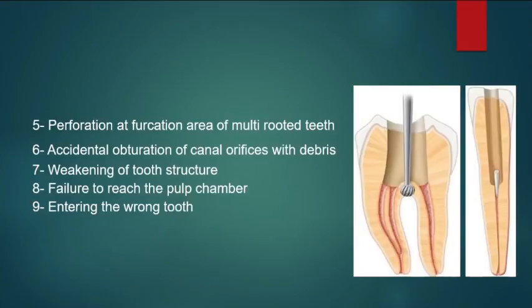This is very possible, especially when you are in a rush and you just want to finish the treatments because you have other patients waiting. So we always have to mark the tooth that we are going to work on, especially when we have identical crowns of adjacent teeth, and that should be done before placing the rubber dam.